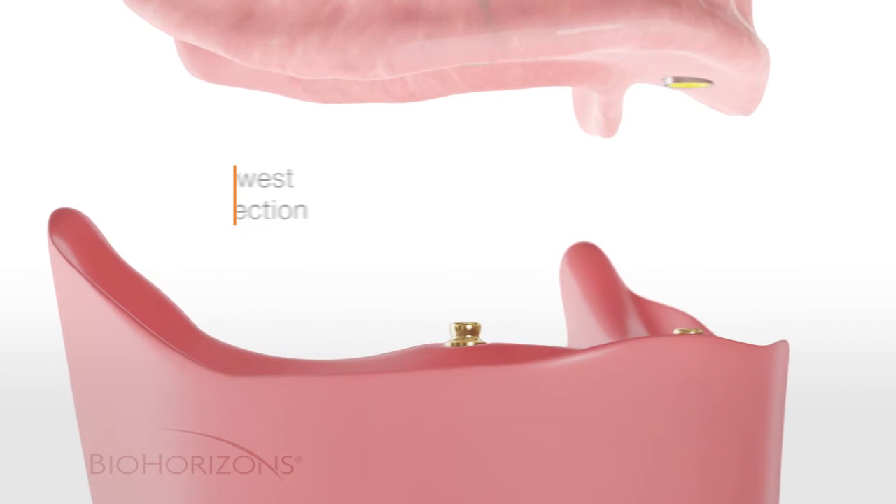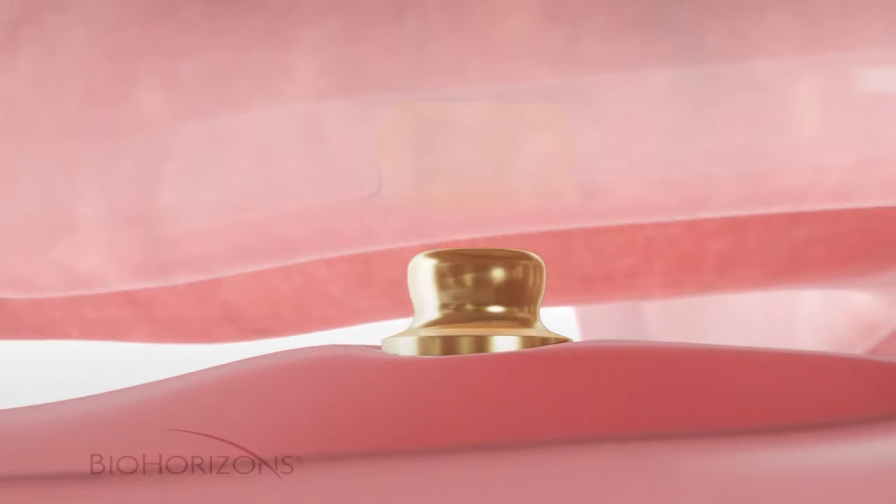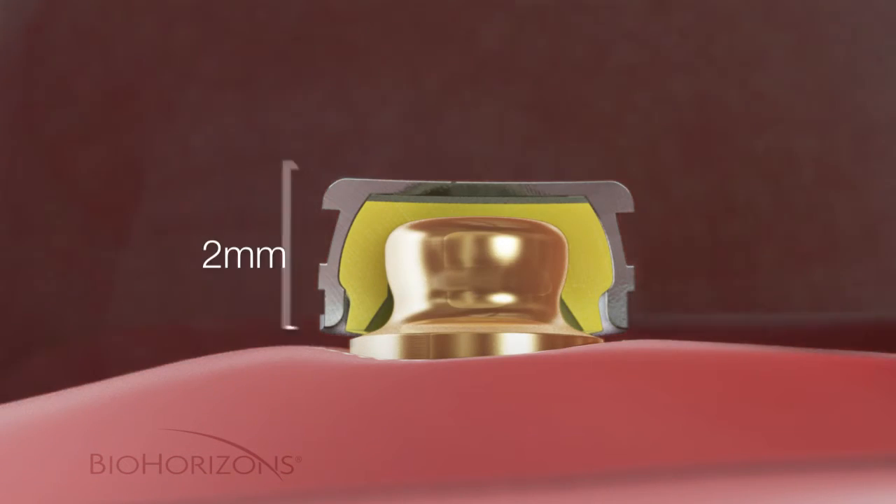The OD Secure uses the industry's lowest profile connection to attach dentures and partial dentures to dental implants. Measuring just two millimeters in height including the healing cap and retentive insert, the OD Secure allows for denture attachment even when restorative space is limited.